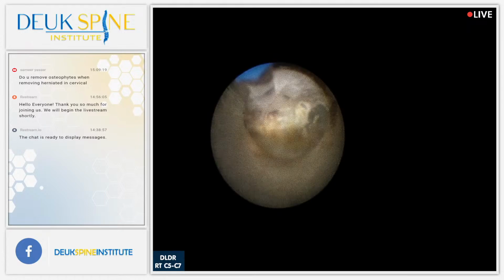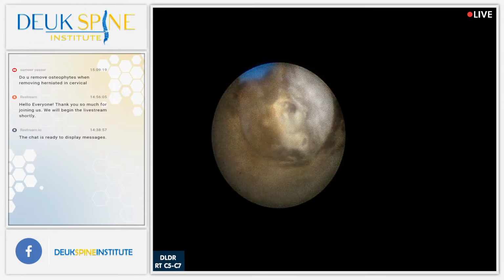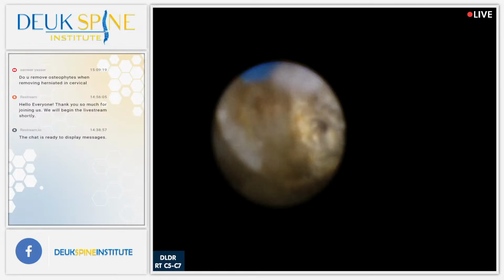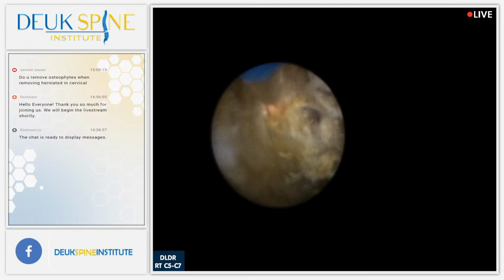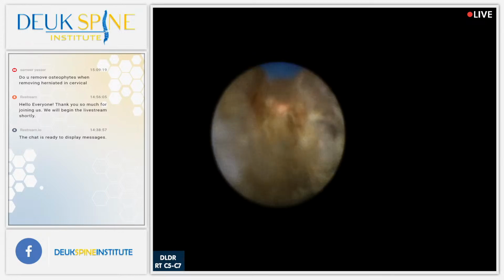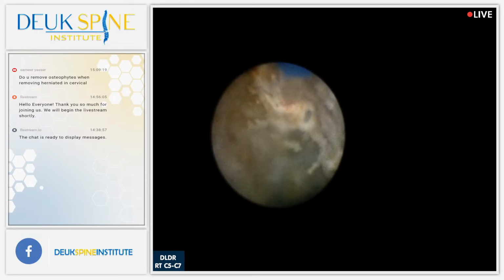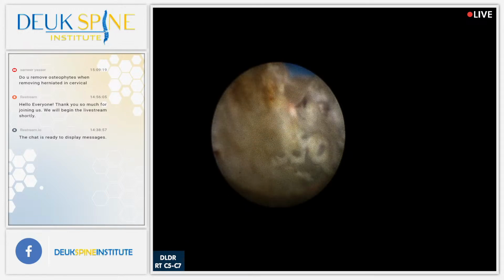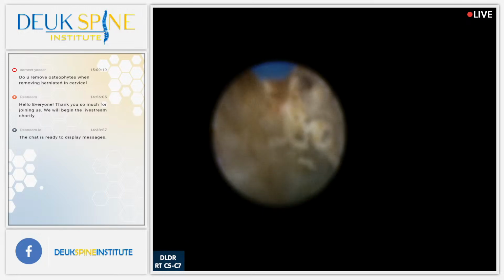Okay. I'm going to flip to the other side. We're going and looking in his left arm now. Left foramen. Thanks, Luis. Massive amount of scar tissue here from his herniations over the years. And this is pressing up near the spinal cord. So I'm going to try to remove as much of the scar tissue herniation I can.